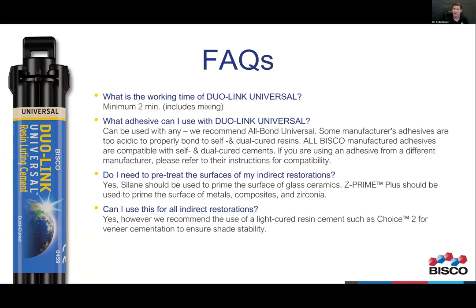Again, in your handout, I've got some extra slides in here. They're straight from Bisco. As far as what adhesive can I use with Duo-Link, they've got an answer for you. Do I need to pre-treat the surfaces of my indirect restorations? It's in there for you. This is all for zirconia though. Notice this slide says zirconia, because that's where we're going next.